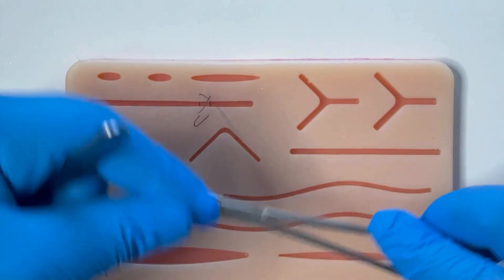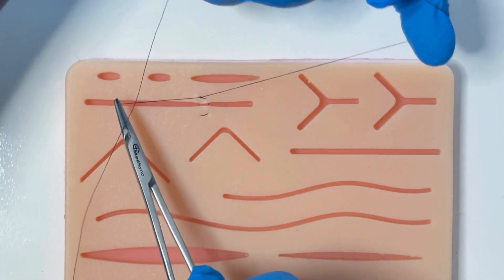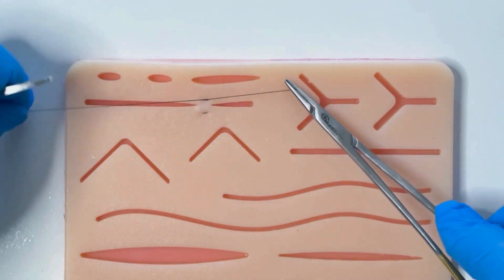This technique is good for wound eversion. It can also be helpful for eliminating some tension.